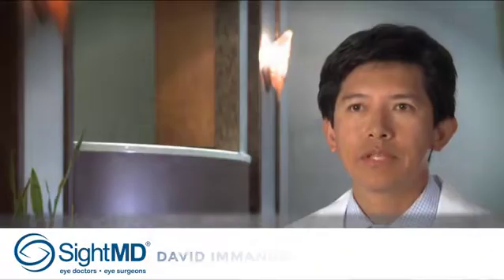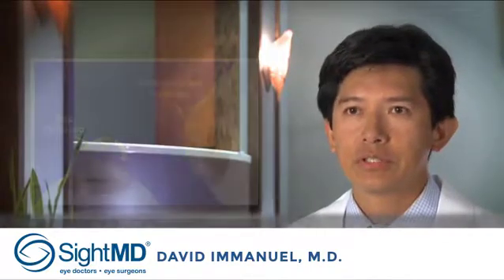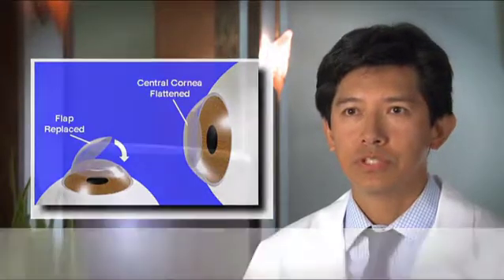LASIK stands for laser in situ keratomileusis. During this procedure, a laser is used to reshape the cornea under a flap to improve your vision and decrease or eliminate your dependency on glasses or contact lenses. A good candidate for LASIK surgery is one whose prescription has not changed from year to year.